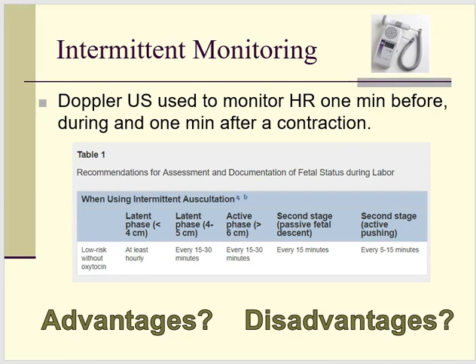Electronic fetal heart rate monitoring began to be commonly used in the 1980s. As we discussed, the intent was that we would catch every hypoxic episode and be able to prevent any damage during the laboring process. Or perhaps use it to screen babies during the pregnancy and pick up those fetuses that might have issues before labor even begins. We have used electronic fetal heart rate monitoring for 30 plus years.